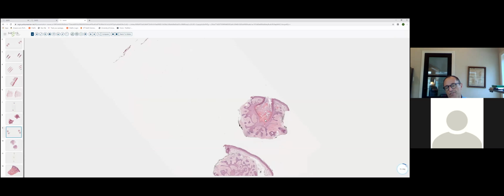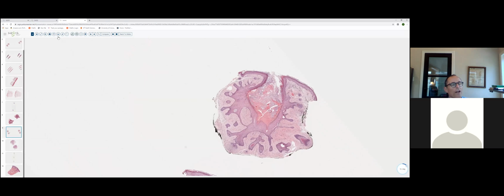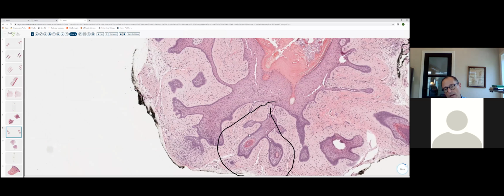And again, we have this cystic invagination of the epidermis, which resembles a very widely dilated follicular infundibulum. But if you look at the epithelial structures radiating from this wall, these are very well-developed secondary hair follicles. They've got a fibrous sheath around them.